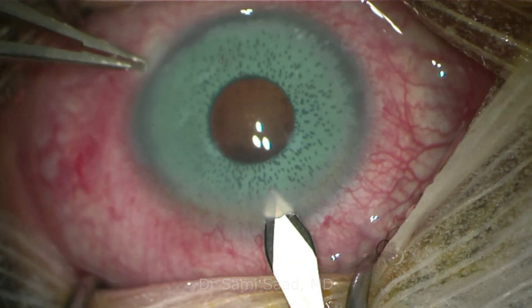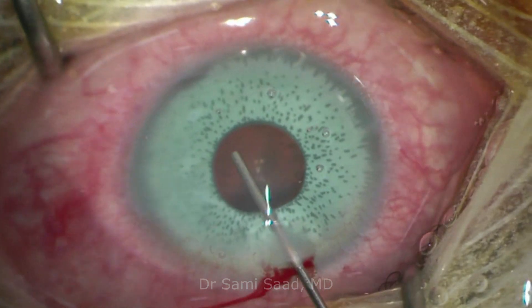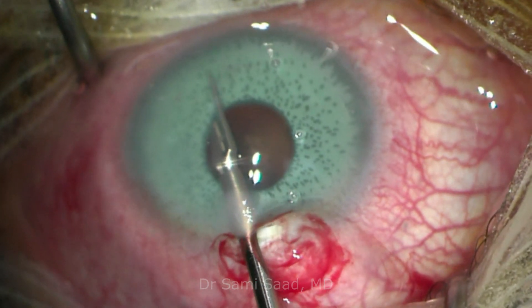In this video, we perform the explantation of an artificial colored iris in a young female patient who was referred to us for ocular hypertension and corneal endothelial cell loss.